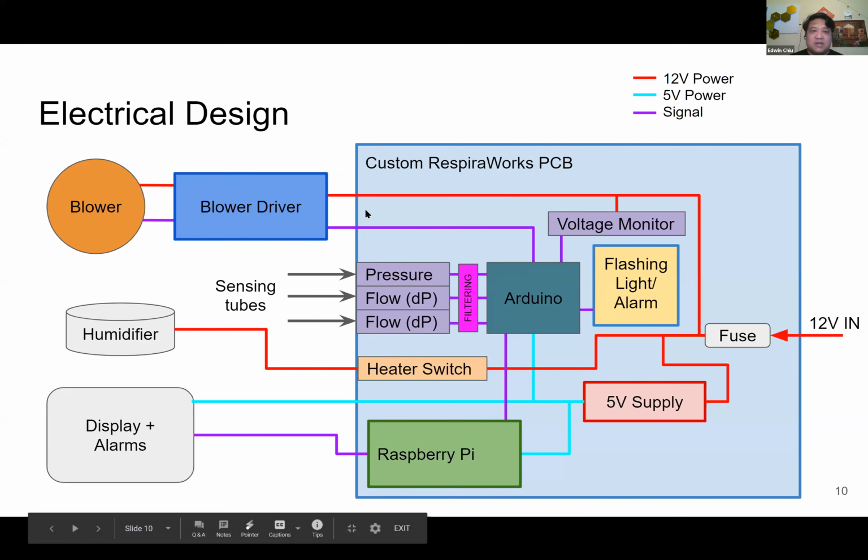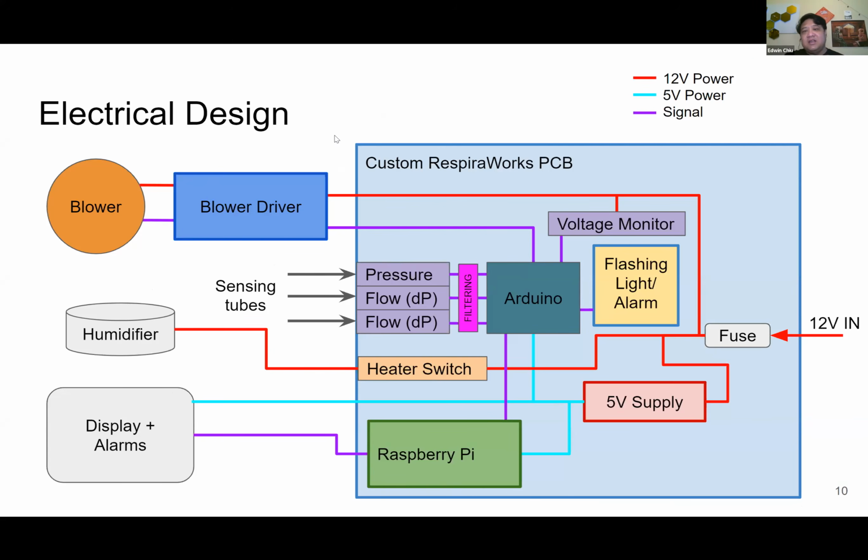One thing about this board, the intention of this design is to try and put all of the electronics on one single board. This does a few things for us. This reduces the complexity of the design so that when assembling this, somebody doesn't have to connect a bunch of different wires to different things. It also improves the signal quality and reduces the risk that we will have electrical interference causing problems between components or noise.